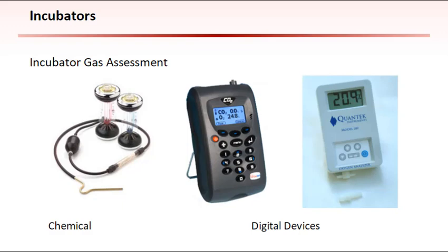However, in this digital age, such measurements are considerably less accurate, specific, and/or repeatable than using other types of detection devices, and its use is not recommended. The use of electronic or digital detection of CO2 is preferred. However, all CO2 detection should go hand in hand with measurement and validation of the CO2 concentration by pH measurements. Oxygen concentration can also be measured by the use of a digital device. There are several manufacturers of devices suitable for measurement of the oxygen concentration within an incubator.